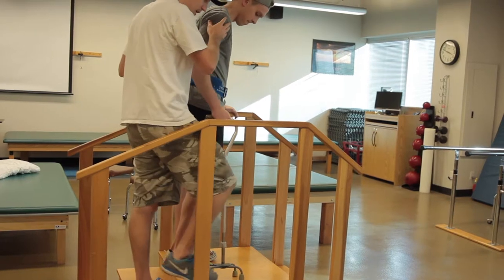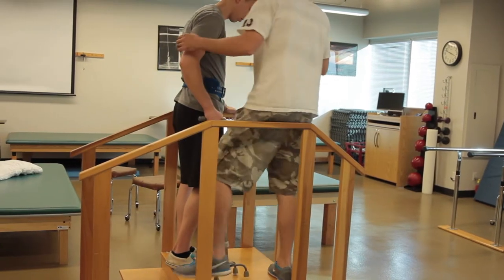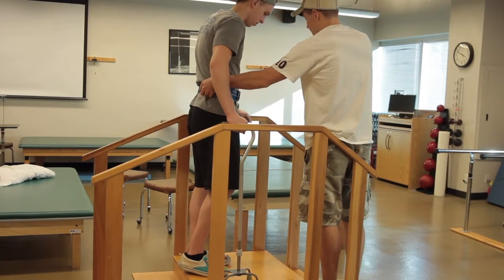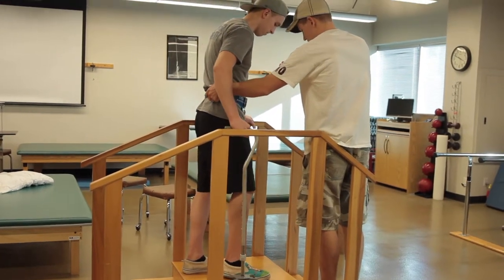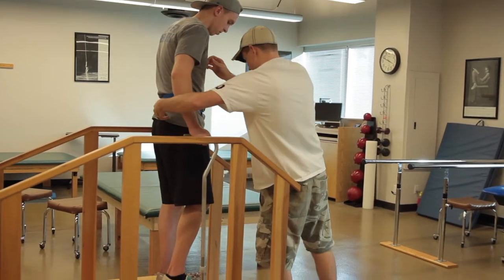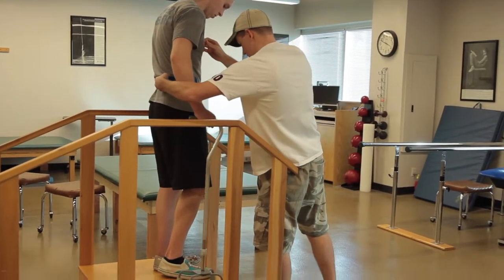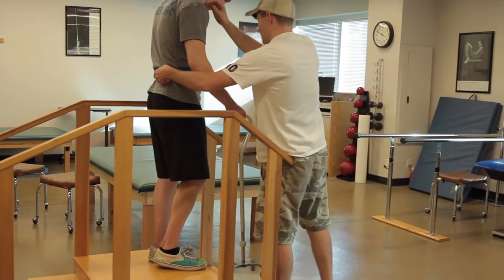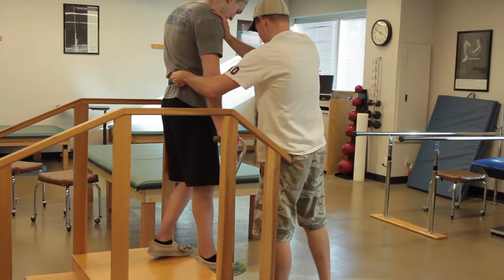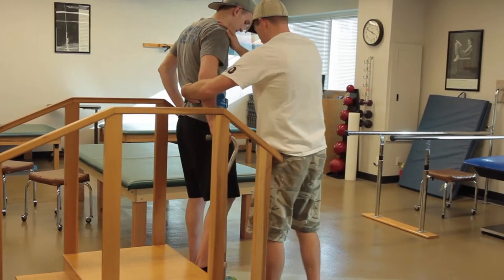Okay, let me go ahead and slide past you here. And so we're going to do the same thing coming down. So go ahead and come toward the step there. Yep, perfect. So now you're going to come down with the cane, and then down go to hell. Good, sorry, good go to heaven, bad go to hell, so down, yep. And then get there, perfect.